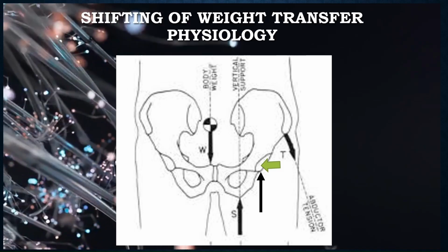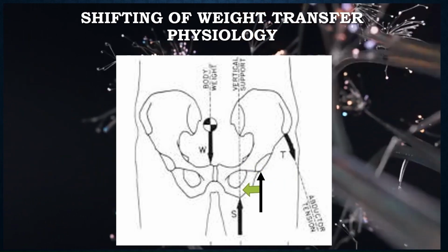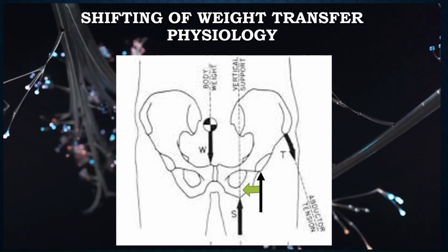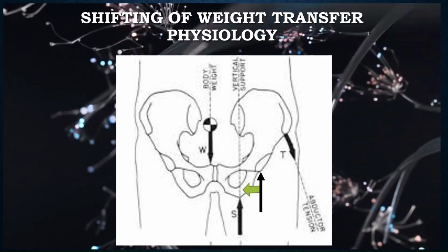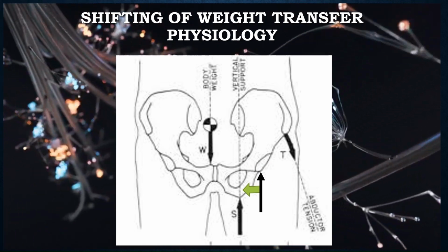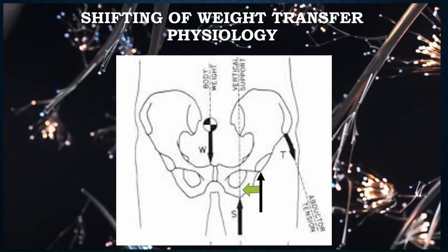The weight is transferred to the femur through the hip joint, however, the weight is transferred to the prosthetic socket through the ischial tuberosity, which is medial to the hip joint. Therefore, the residual stump does not participate in the weight transferring mechanism in the quadrilateral socket.